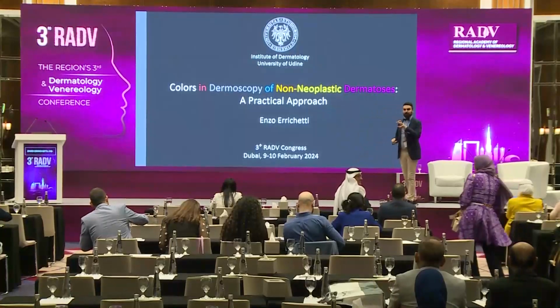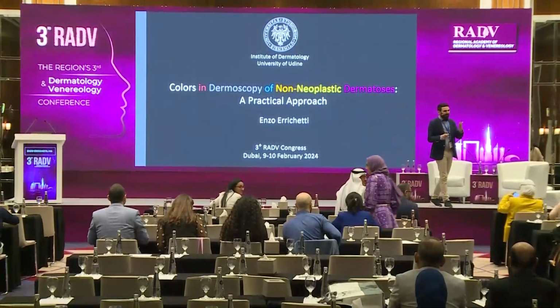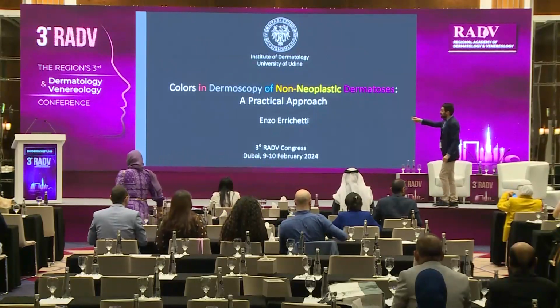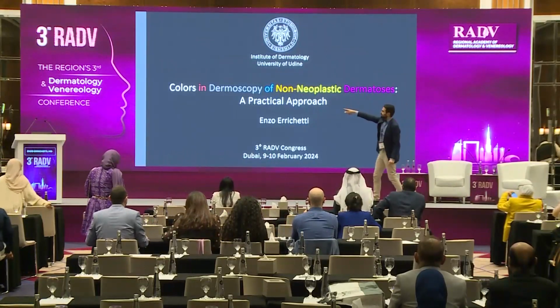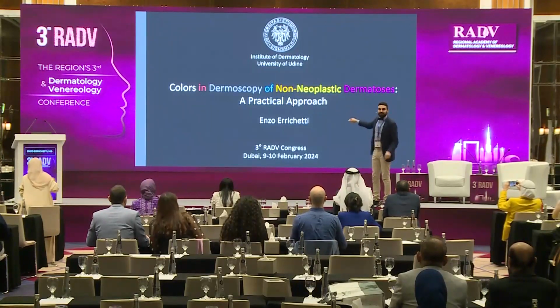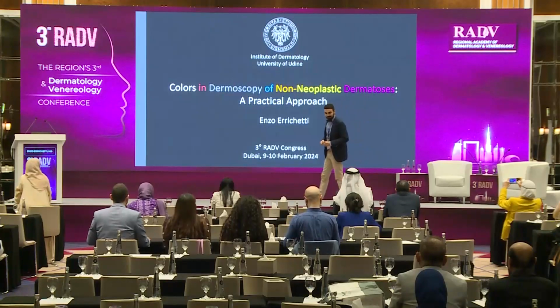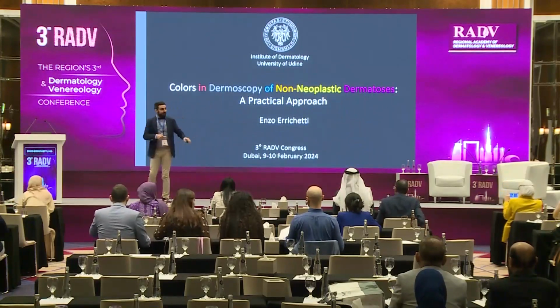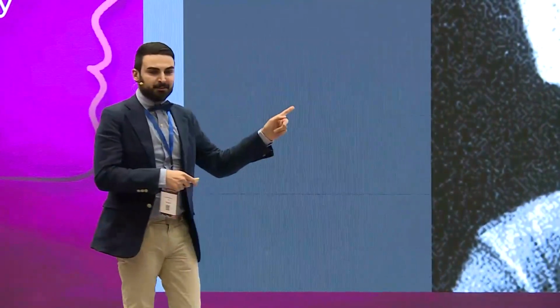So today I will speak about dermoscopy by starting from colors. I didn't do it on purpose, but on the first line of the title, there are all the colors we can see in dermoscopy in inflammatory diseases. But we will see them later. So, let's start with this.